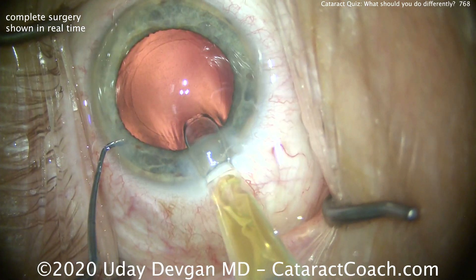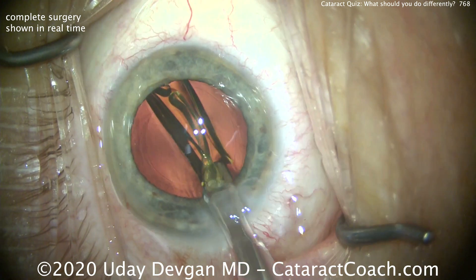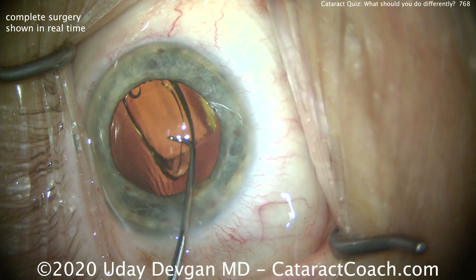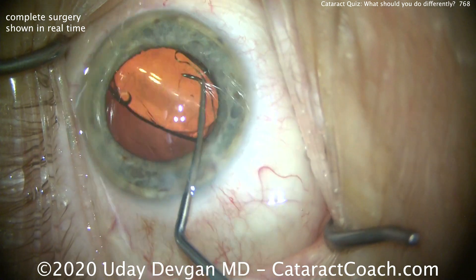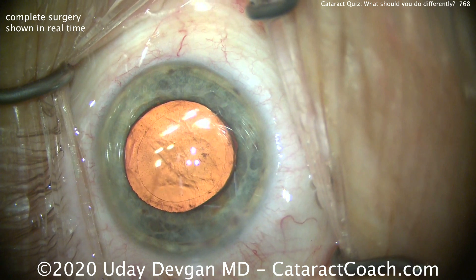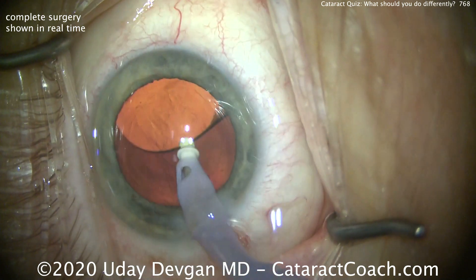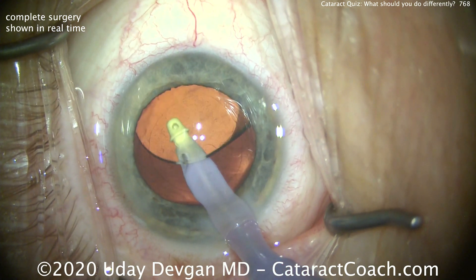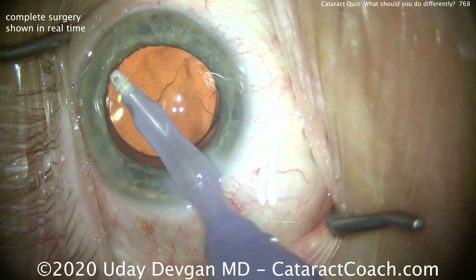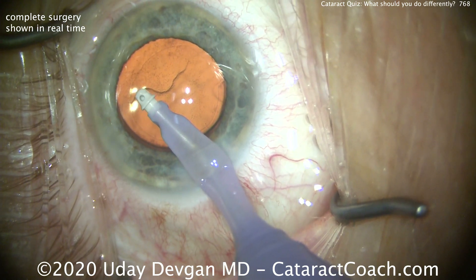Should you have done a combined phaco and DMEK surgery? Not necessarily in this case, because 80% of the problem was the cataract. Just fixing the cataract alone should be enough to restore this patient to very good visual acuity. In fact, in the post-op result this patient ended up with about 20/25 to 20/30 visual acuity with correction, and is quite pleased. This patient will be monitored routinely with endothelial cell counts and corneal pachymetry. If DMEK is required, we can certainly do that at a future date. The stepwise approach is very wise in these cases.